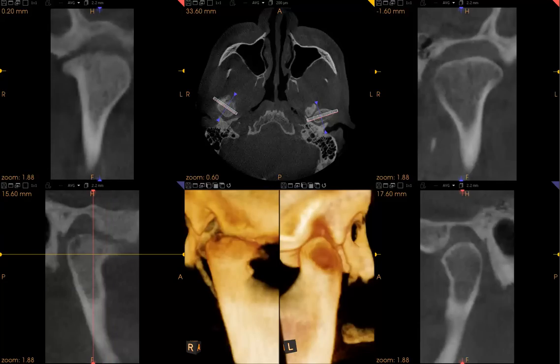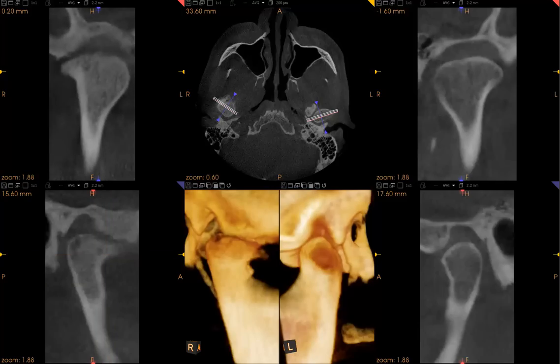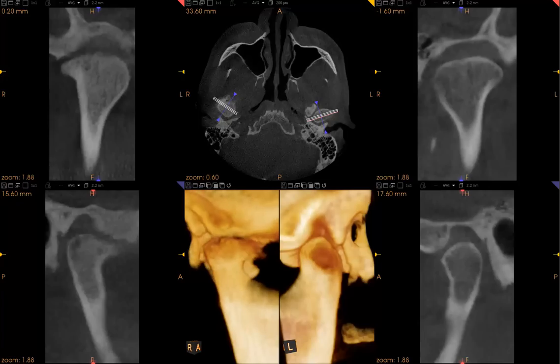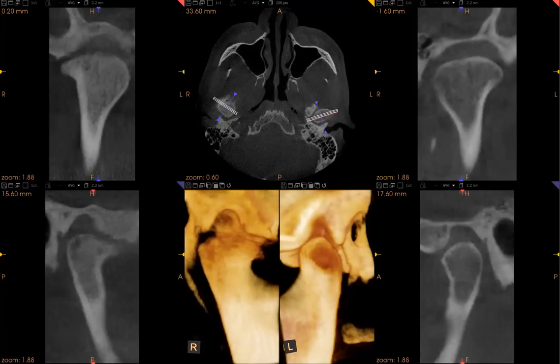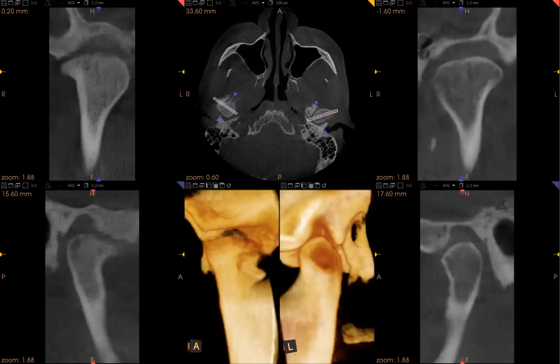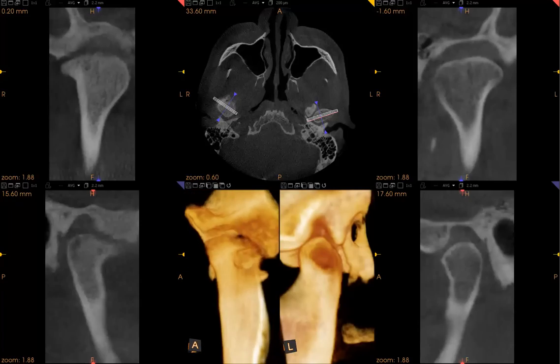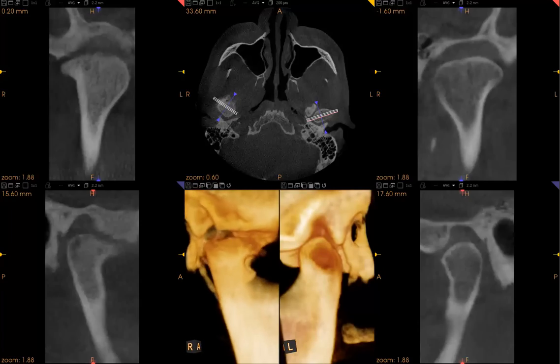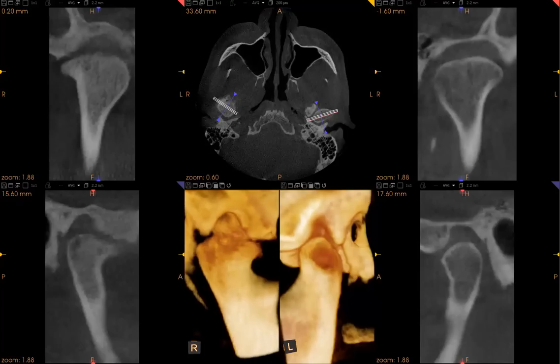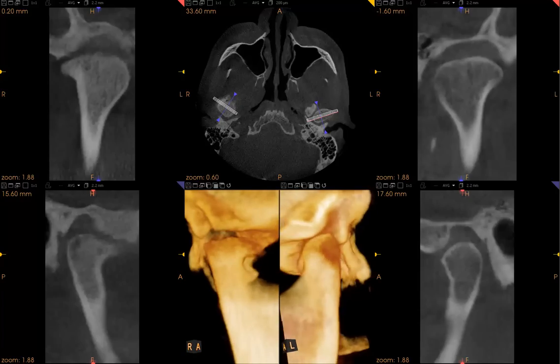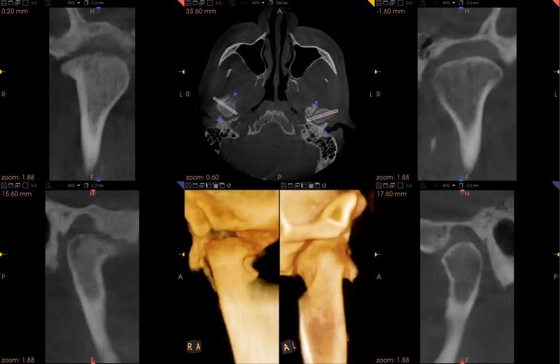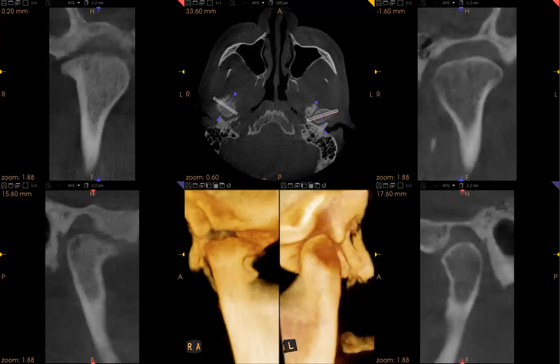What's nice about this is we can also take the scan as reproduced into a three-dimensional image. You can see here the joint is quite diseased and broken down on both the condylar surface as well as the articular eminence. When we compare that to the other joint — the left joint — it looks relatively normal, well-positioned, and healthy.